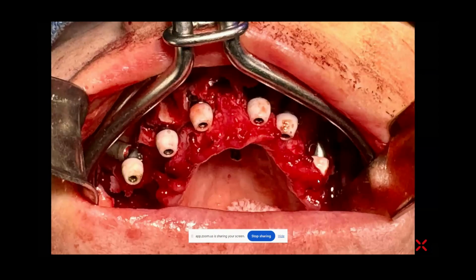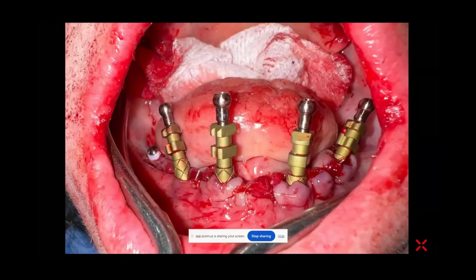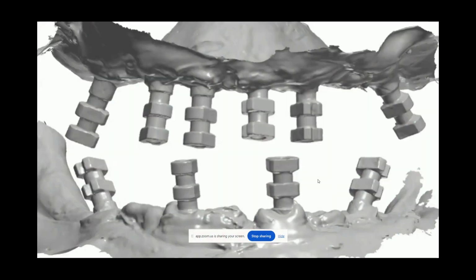But this is a case where I did the zygomatic implants, the transnasals, and we'd have our palatal marker and the mandible, because obviously we weren't able to use any kind of photogrammetry here. We have the matrix scan bodies, and you'll see we connect them, take a very accurate impression. This turned out to be a perfect case. This patient was quite pleased, and it was worth the trip for her.